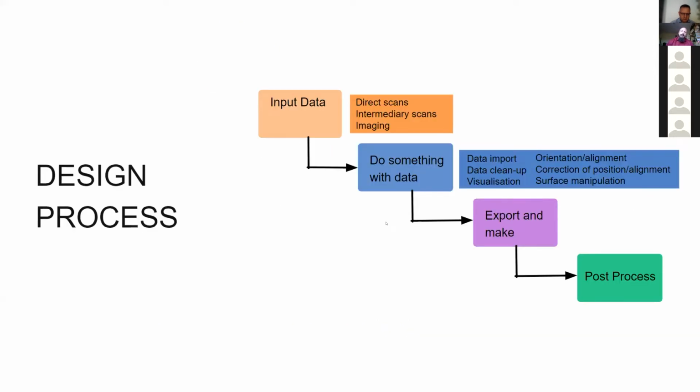Trying to automate these repetitive steps is what we are all about. We have been able to successfully deliver automated design systems for a number of businesses around Europe and North America.